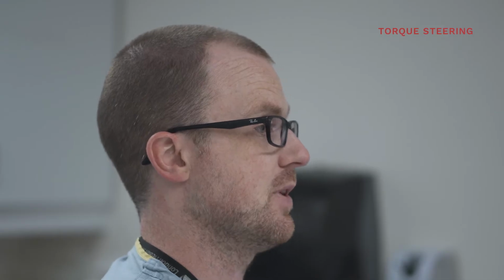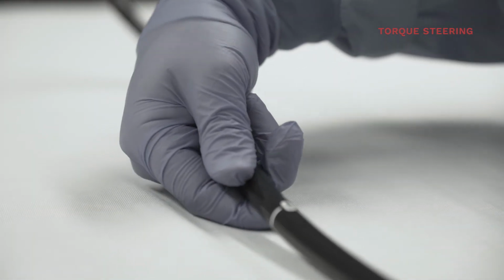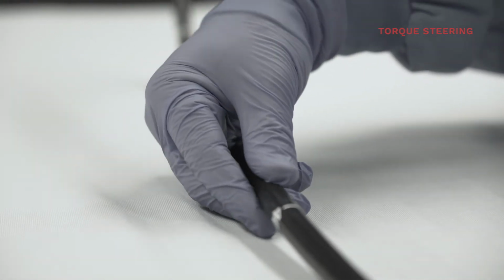This technique involves applying rotational torque to the shaft of the colonoscope. This technique can be applied via the endoscopist's hand on the scope or by rotating the patient. Tip steering, although a valuable technique in many situations, is rarely required when advancing the scope to the cecum.